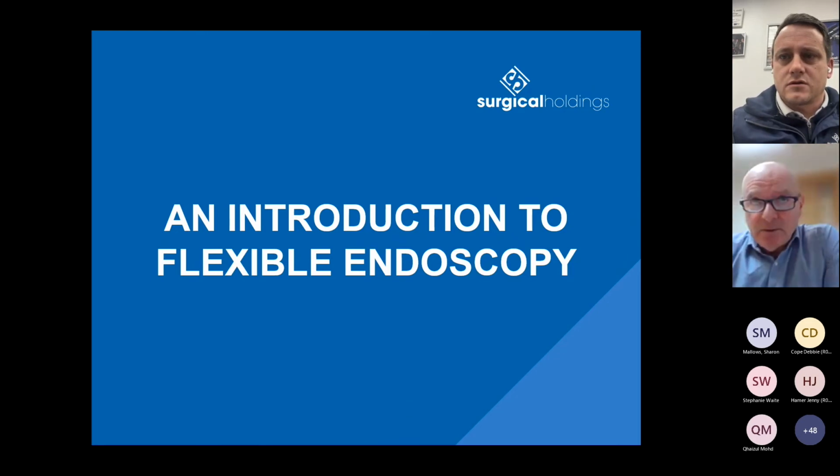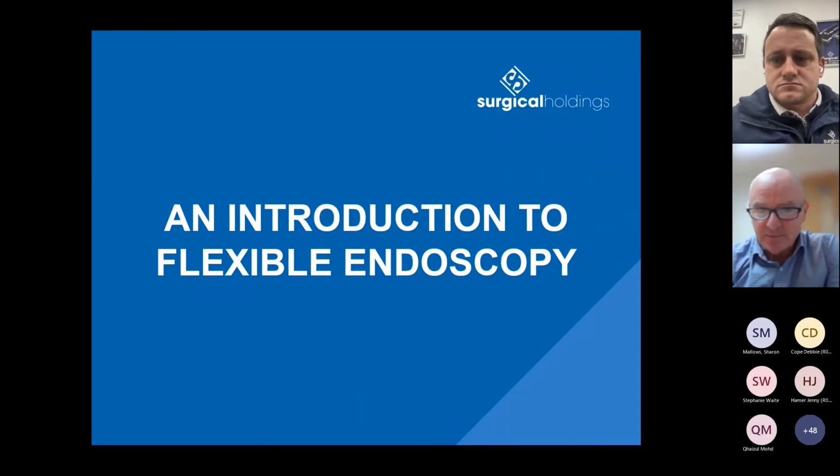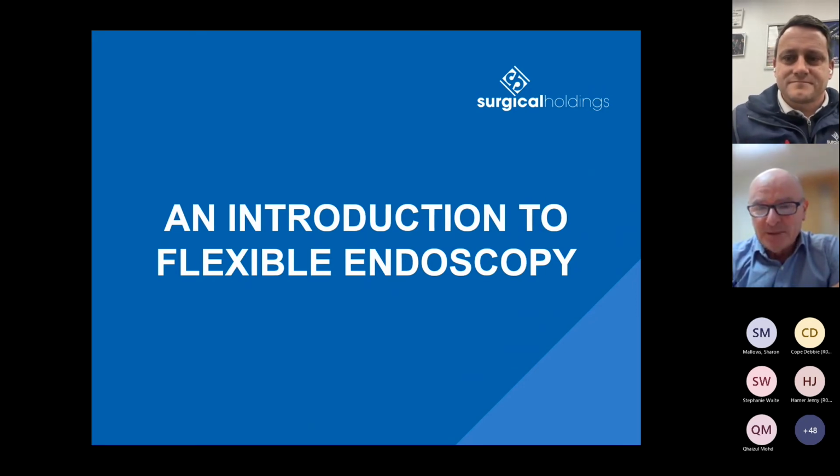And you can test with leak testing, and again, your endoscope supplier will be able to give you advice on leak testing, because there are a lot of different ways of leak testing, either using fluid or using air blowing it up. And I'm sure, depending on the manufacturer, they'll say one is better than the other. I'm not going to make a comment on that, but leak testing will hopefully prevent those very expensive fluid ingress issues.